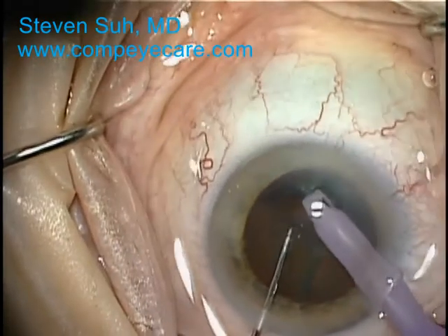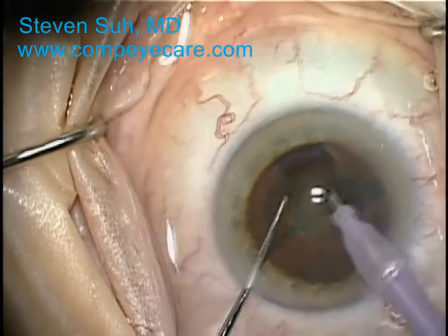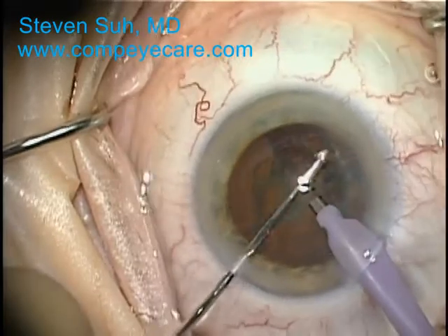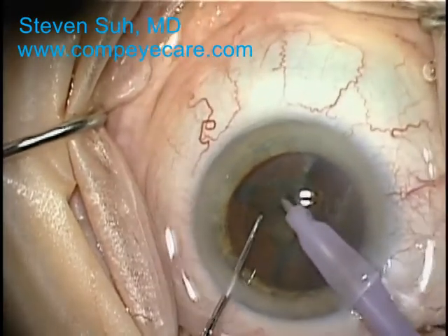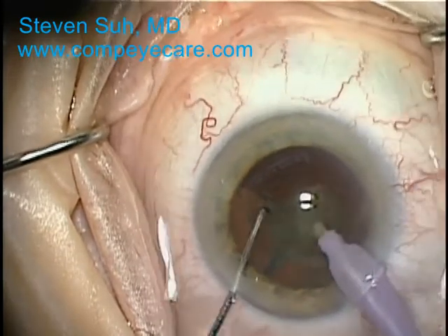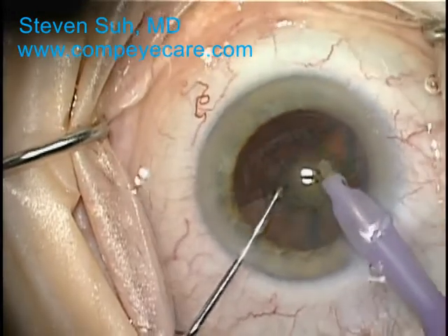The phaco energy and vacuum are controlled by a foot pedal. The harder I press on the pedal, the higher the energy and the vacuum levels. So after the cataract is divided, I am able to remove the pieces out of the capsule. I would consider this a medium density cataract. More dense lenses will usually take more energy to break them up.